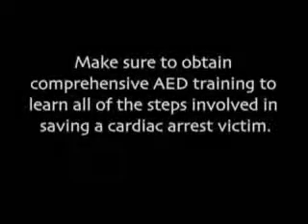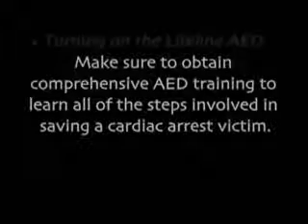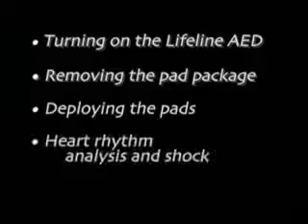Make sure to obtain comprehensive AED training to learn all of the steps involved in saving a cardiac arrest victim. Now let's review the basic steps involved in actually using the Lifeline AED.